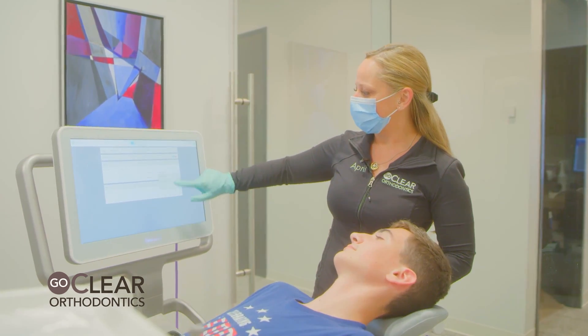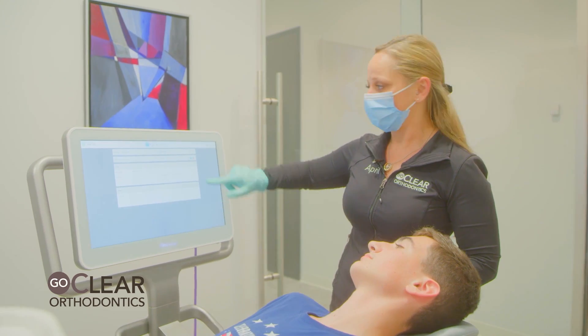On the scanner for refinement, make sure you have progress record chosen. Now we're going to scan.